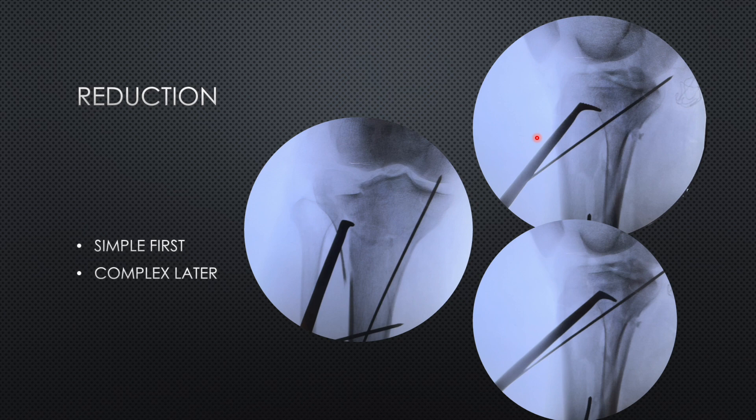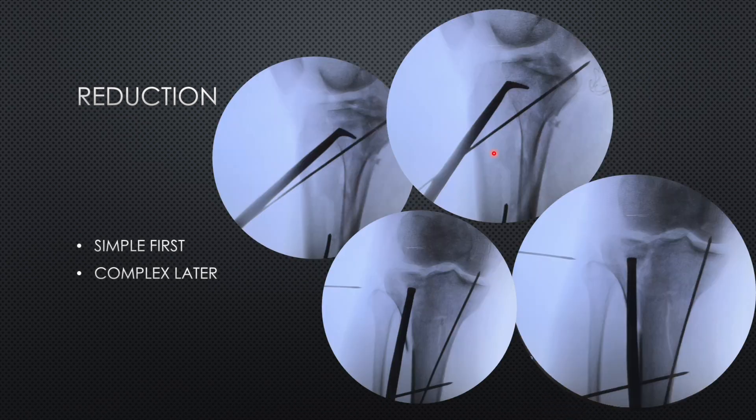Now we proceed towards the lateral condyle, which has comminution and a depressed fragment as well. There is a large depressed fragment visible in both AP and lateral view. We used an L-shaped punch to reduce this depressed fragment. While serially checking the AP and lateral view, we are able to lift the fragment to a higher level, ultimately bringing it to a near-normal level — quite close to the anterior margin of the lateral condyle.